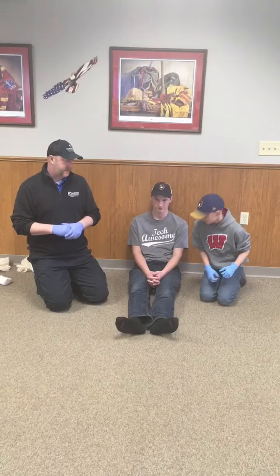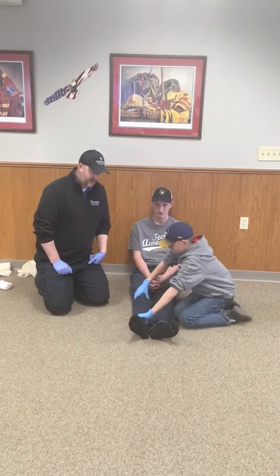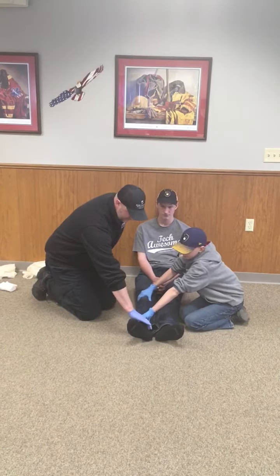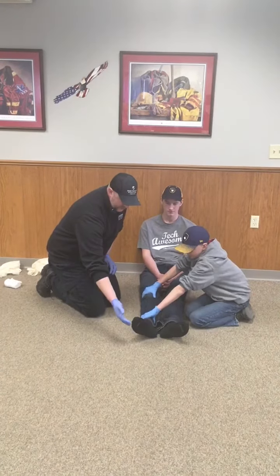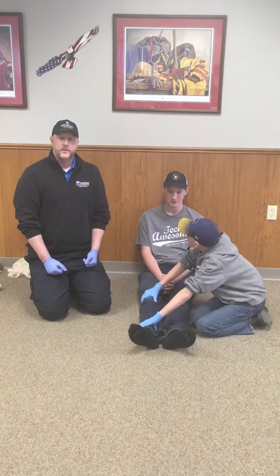As we're starting any of our skills, make sure that you're wearing the appropriate BSI. My partner is going to take manual stabilization of the fracture, and I'm going to check my distal CMS — checking for a pulse at either the posterior tibialis or the dorsalis pedis. Have the patient wiggle their toes and check for sensation. Once CMS is done, we're ready to splint.